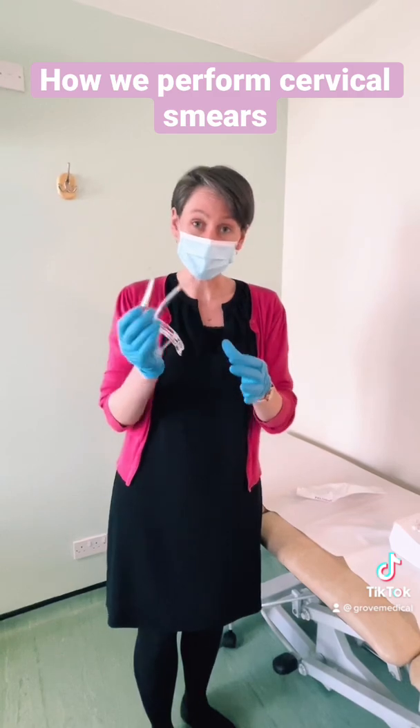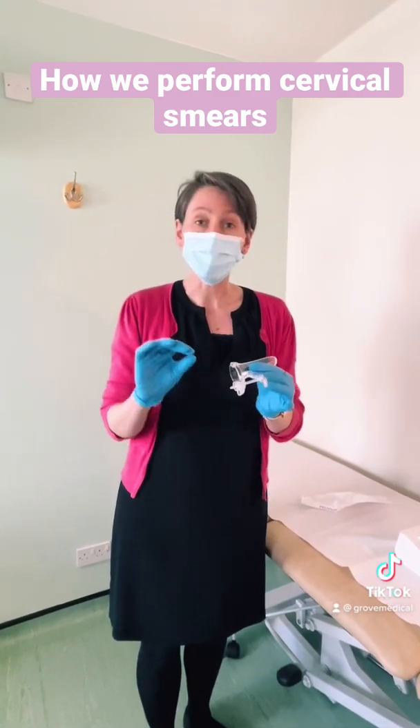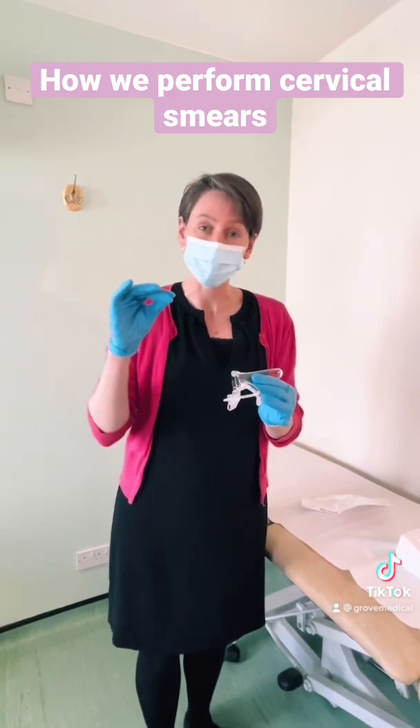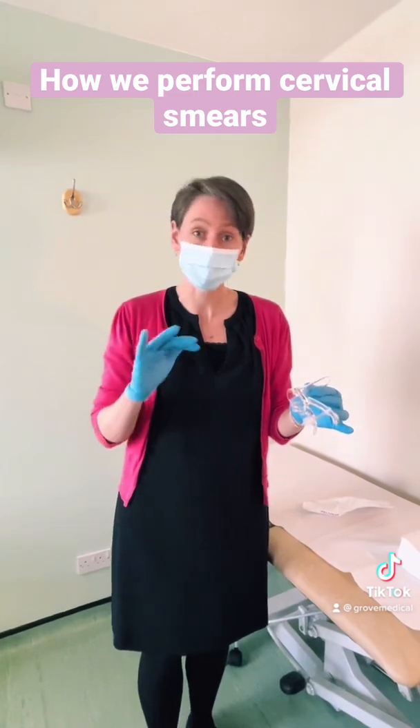As you can see it opens up so we can take a good look at the cervix. But we don't open it immediately — we gently insert it, and what I tend to say is: tell me if you need me to stop at any point. Come and take a look.